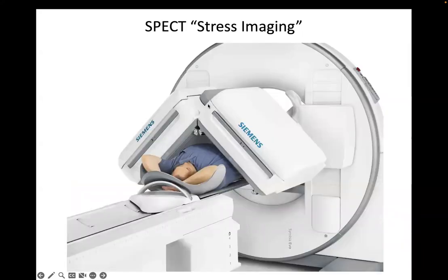So this is the geometry of a modern SPECT scanner used for cardiac imaging. And the detectors themselves that will detect those gamma rays coming out are organized to wrap around the patient as much as possible. And then this whole gantry can rotate freely around the patient to get different angular views. So this person's lying there, and they're going to lie there for anywhere from 5 minutes to half an hour. And these gamma rays will come out of their body and get detected by this guy. Usually you leave the detector in one angular configuration for a finite period of time, let's say 30 seconds, a minute, and you get that view, and then the whole thing clicks around and you get another view. And so you add up your views that way.